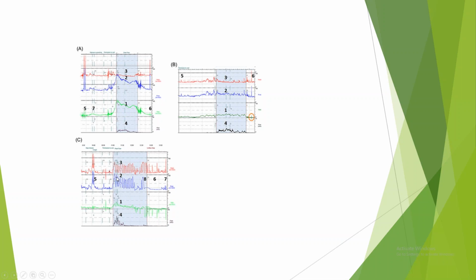Okay. Now, in this third graph, can you see there are repeated spikes? In abdominal pressure also there are spikes. Vesical pressure also has spikes, but detrusor pressure is not rising that much. And while emptying also she has spikes in the flow. So this might be due to repeated Valsalva or repeated straining. Okay. So these are the voiding dysfunctions. You have to interpret like that.